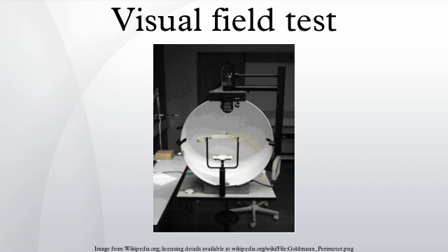Methods of stimulus presentation. Static perimetry. Static perimetry tests different locations throughout the field one at a time. First, a dim light is presented at a particular location. If the patient does not see the light, it is made gradually brighter until it is seen. The minimum brightness required for the detection of a light stimulus is called the threshold sensitivity level at that location.